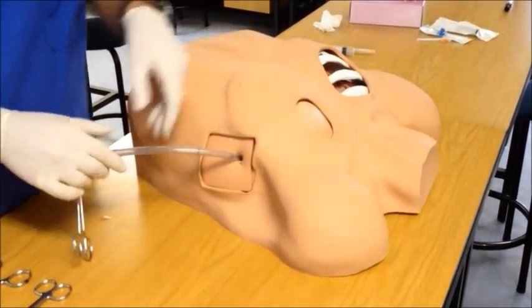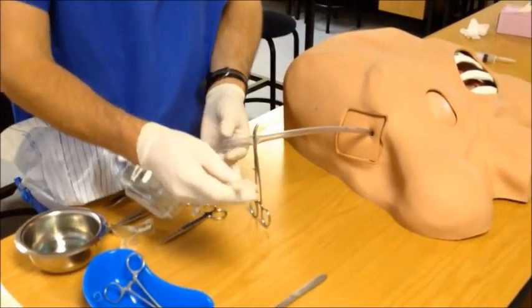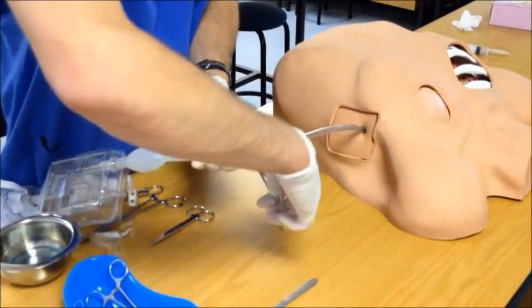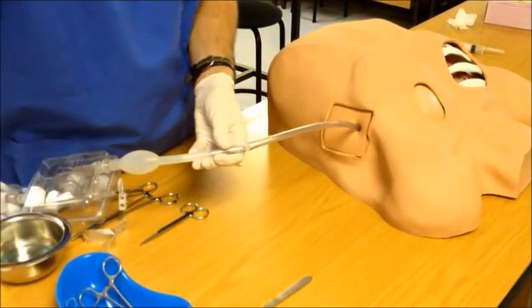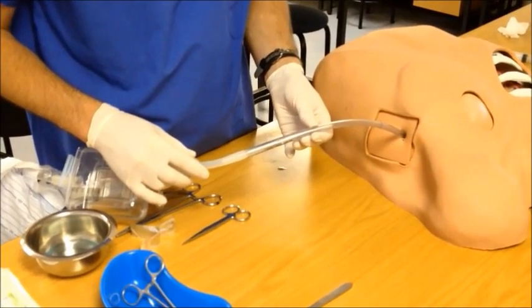Once the tube has been inserted, connect it to your underwater drain system to confirm position. Connect your system to the end of the tube first and then remove the artery forceps. Use standard techniques to confirm the position of the tube.